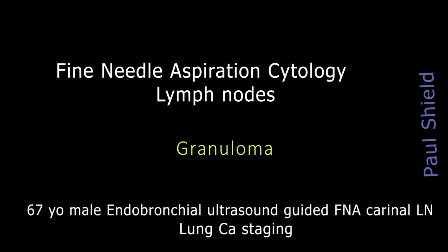Hi everyone, it's Paul. We're just going to look at one quick case of granuloma in a lymph node. This case is a 67-year-old male who was having the procedure performed as part of lung cancer staging.